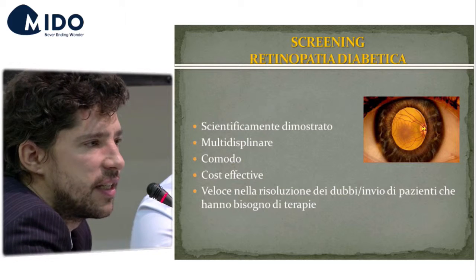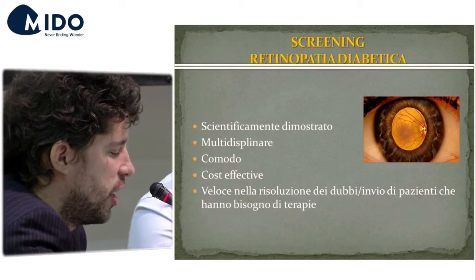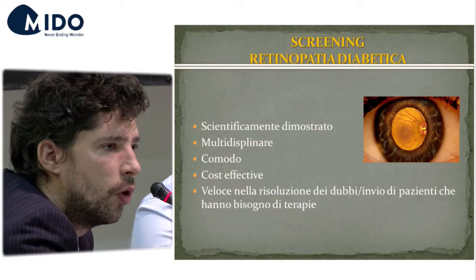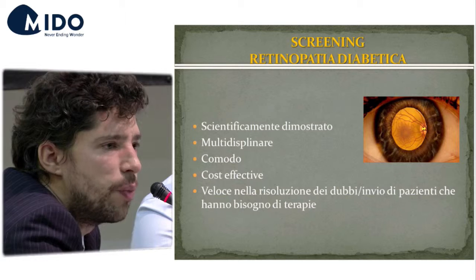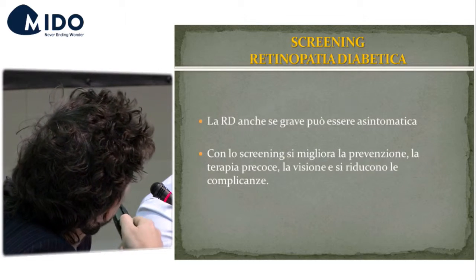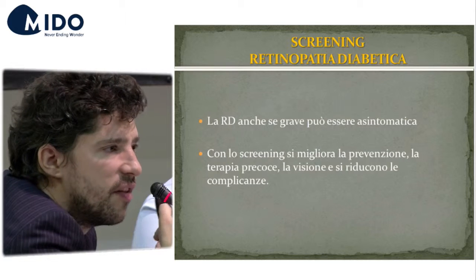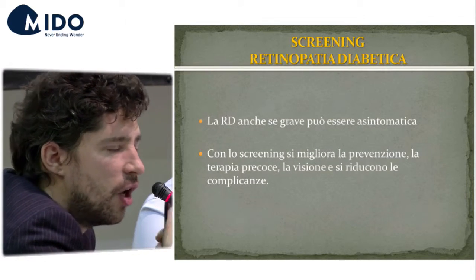If you have a program and a technician performs a test, then the physician visits the patient. If it's a physician performing this, it means that you prescribe a therapeutic plan, and also for very severe forms, proliferative diabetic retinopathy that needs to be photocoagulated.